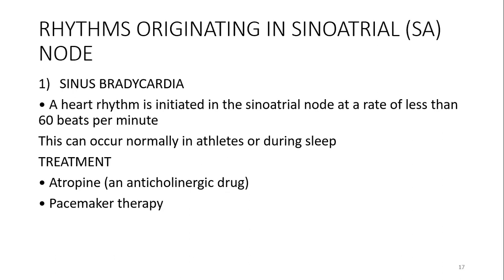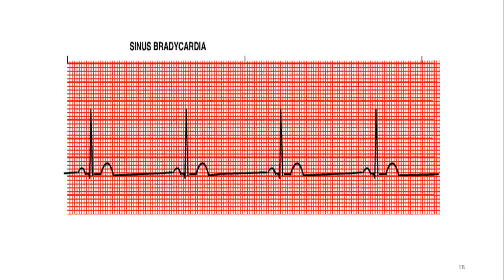So this is an ECG strip showing sinus bradycardia. It's sinus because all the waves are there as they ought to be, but the problem here is that the rate is slow, so it's sinus bradycardia. You can see the P wave there, the QRS complex, the T wave, and you can even see that this P wave is in about 4 small boxes. So that is normal, because we said, the PR interval I'm talking about now, should be between 3 to 5 small boxes.